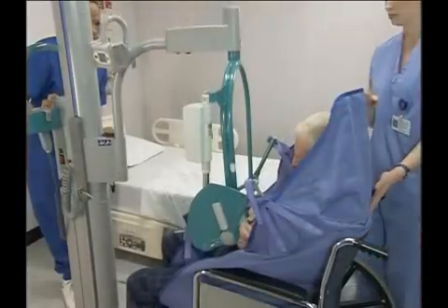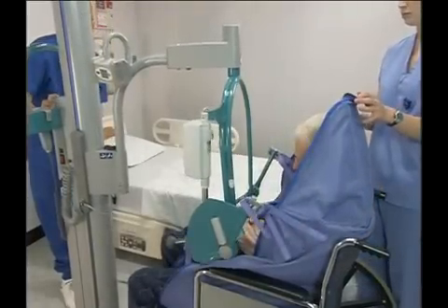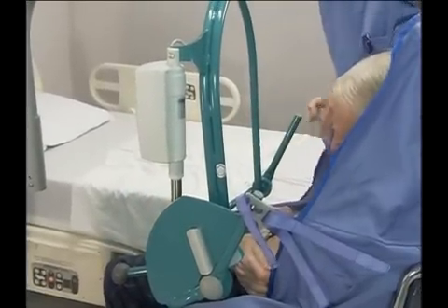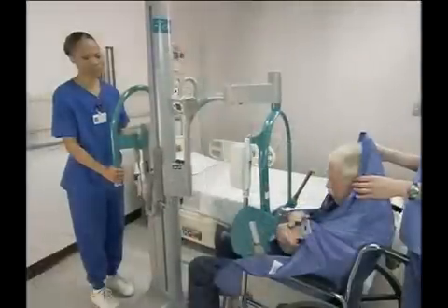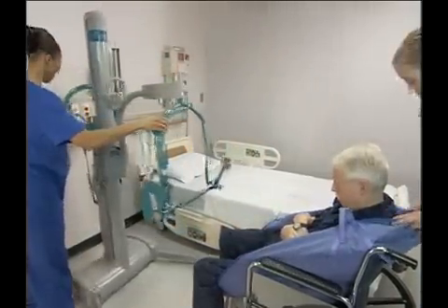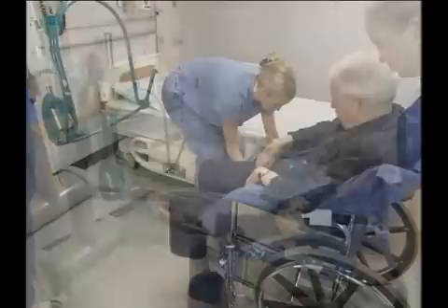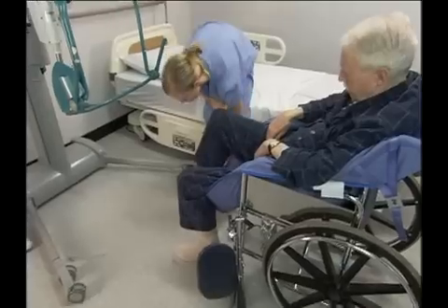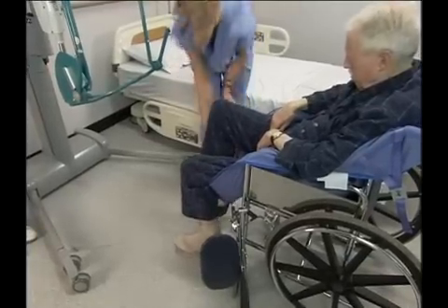Make sure the person's buttocks are at the back of the chair. Release the sling from the swivel bar. Then move the lift out of the way. Leave the sling under the person so it's ready for his return to the bed. Reposition the wheelchair's footrests and armrests and put the person's feet on the footrests.